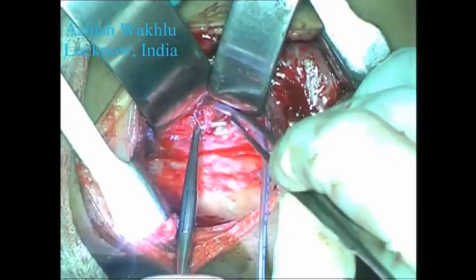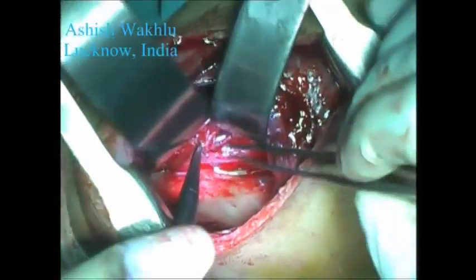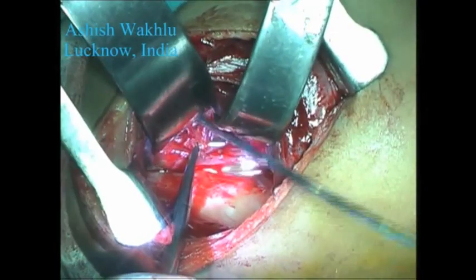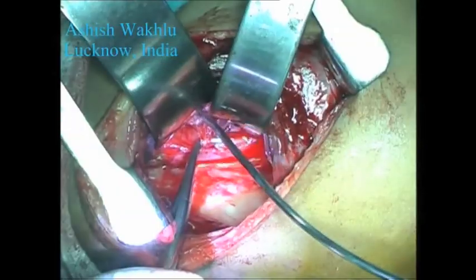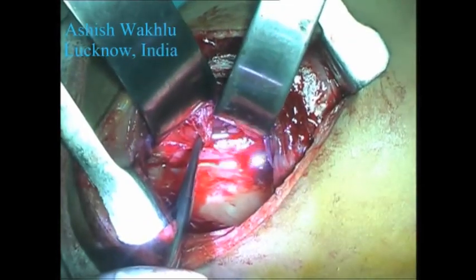So we are testing distal bronchial patency using a feeding tube towards the upper and lower side. And after this will be the turn of exposure of the stump of the right main bronchus.